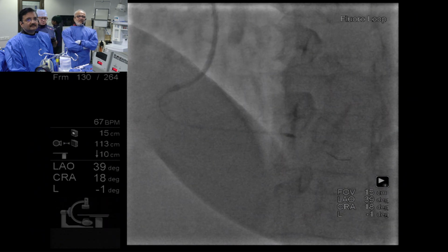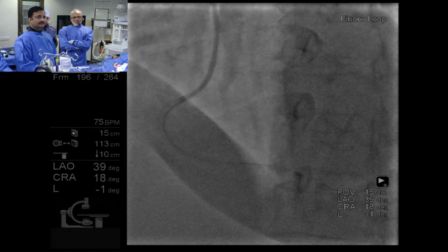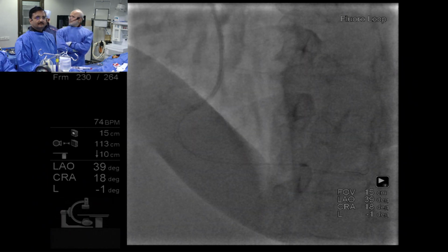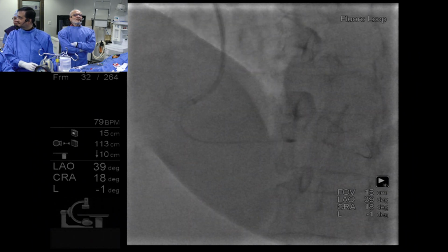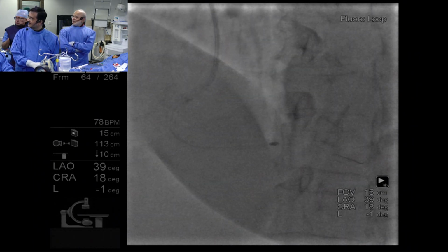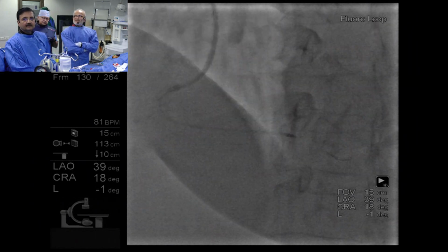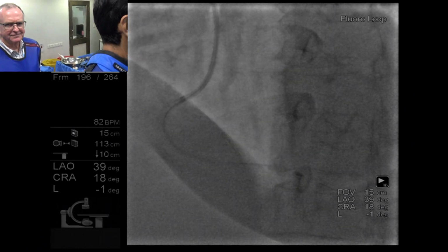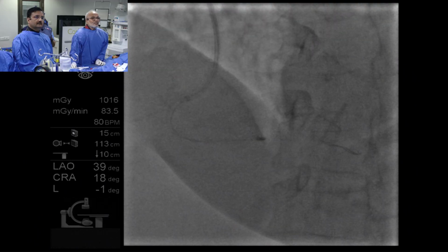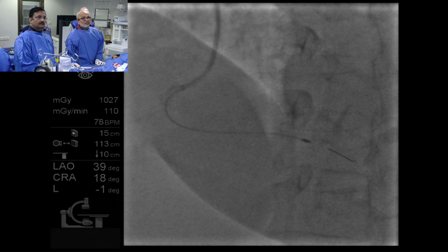I think the AV nodal branch is going from that area. That can also cause some embolic material. I'm not sure if the panelists can actually see the rhythm, but up until then it was just perfect sinus rhythm, and then some 2-to-1 AV block, very temporary for 4 or 5 beats. Yes. So it proves your point. And I think a beautiful movement of wire as you were rotablating, because the hard and the soft part, that's the point that you want to avoid when you're rotablating.